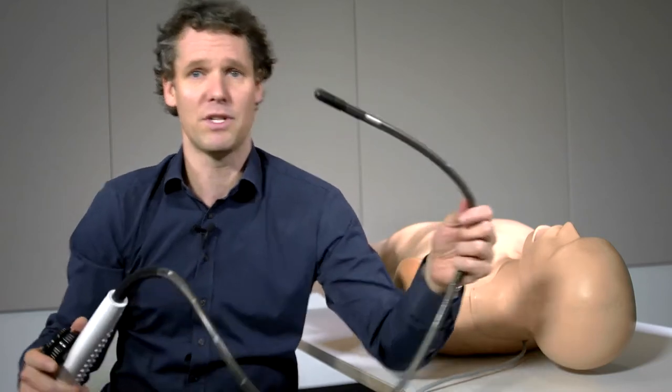When inserting the probe, I follow the soft palate and hard palate — insertion takes a little bit of practice. In terms of learning the insertions, you get the hang of it after about ten procedures. For the whole process of knowing how to do transesophageal echo, after about fifty procedures you get the hang of it and are able to proceed with independent learning.